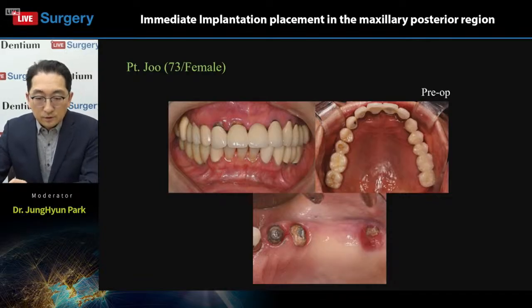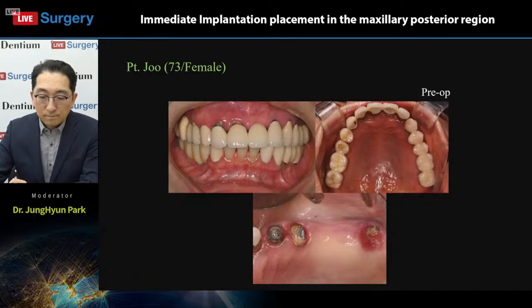Yes, these are the before and after photos of bridge removal. We can see that the second molar has only residual roots remaining. 25 looks fine in the photo, but the distal root caries extended deep below the gum, and there was mobility, so we decided to extract it.